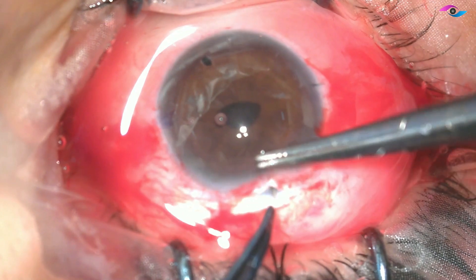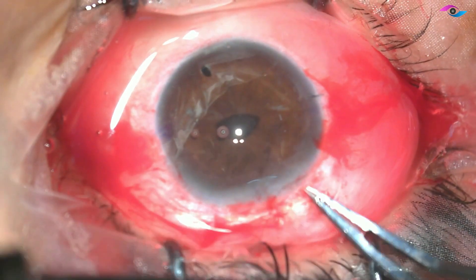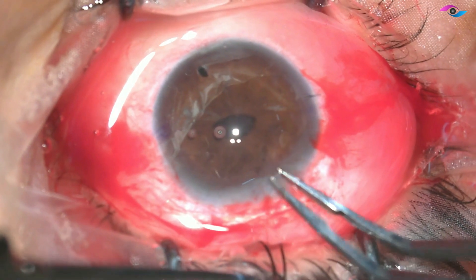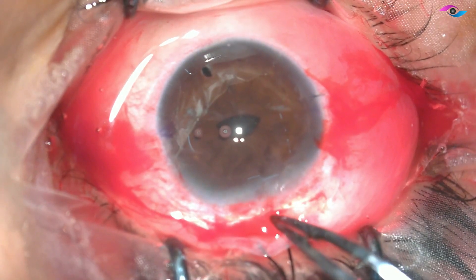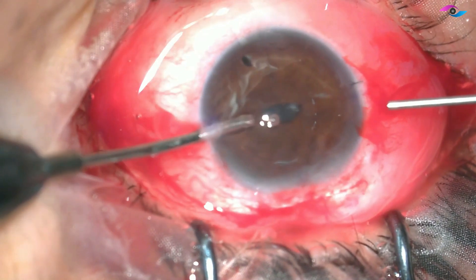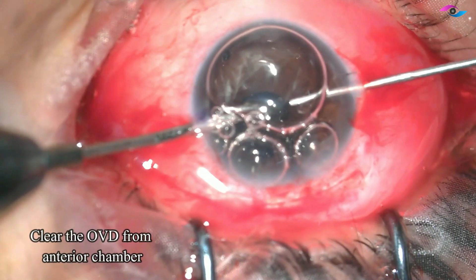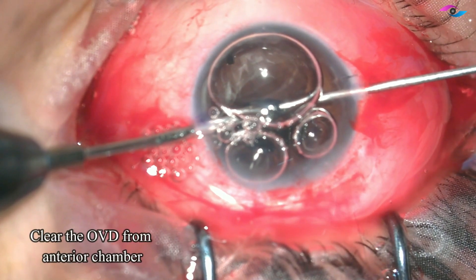Since this is a vitrectomized eye, I prefer to put a suture in such eyes — just one single suture is enough because we have already created a very nice self-sealing tunnel. We suture the incision and then clear any remaining viscoelastic substance from the anterior chamber.